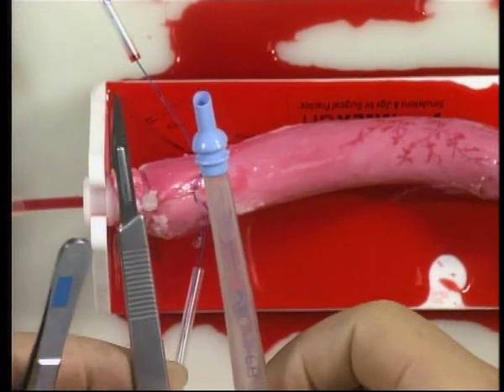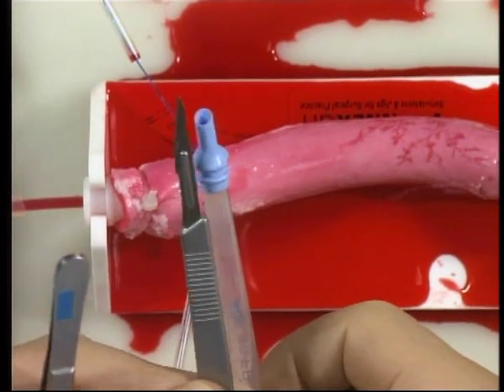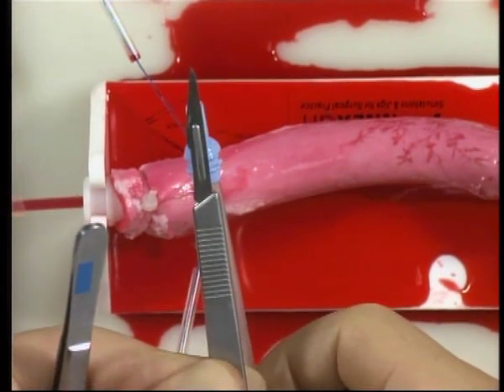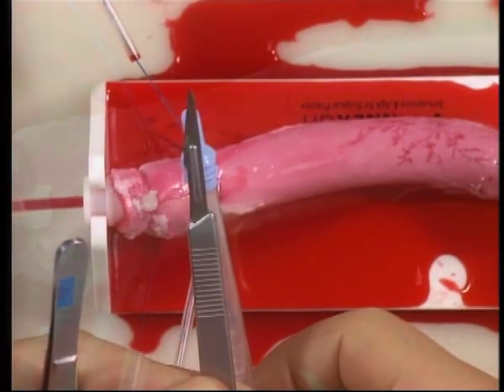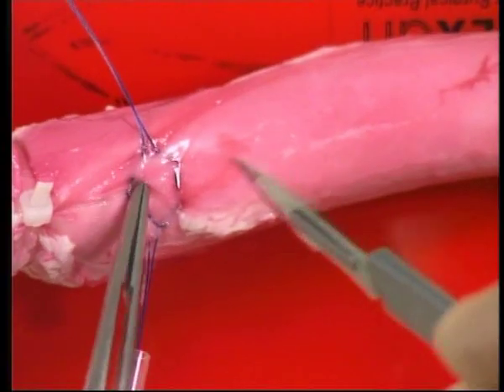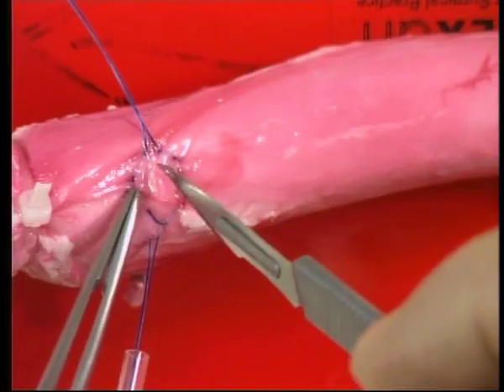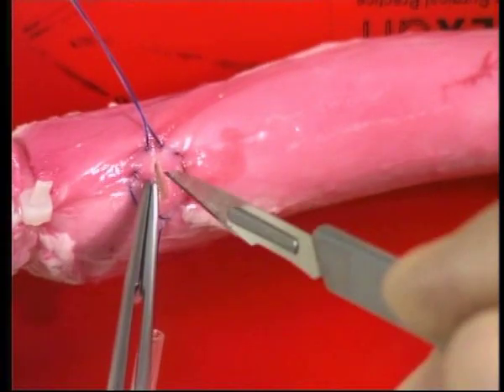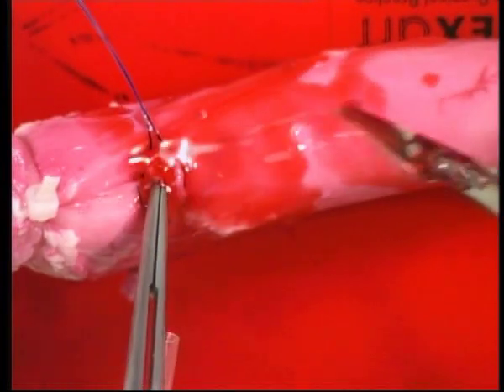We use an 11 blade knife to make the aortotomy because, as you will see, it is approximately the same diameter as the aortic cannula. Raise a transverse adventitial flap within the purse string and then make a simple stab incision and cover this with the flap.